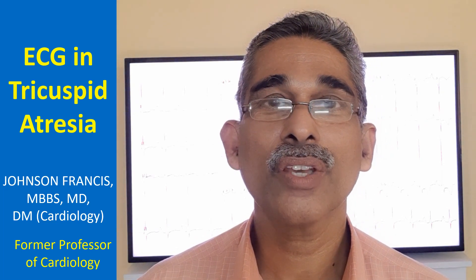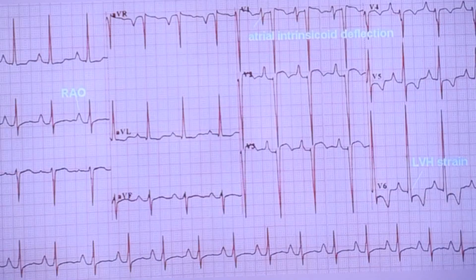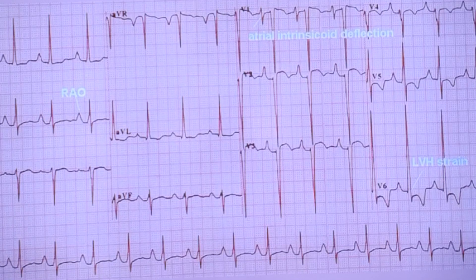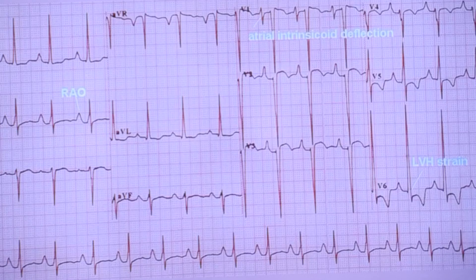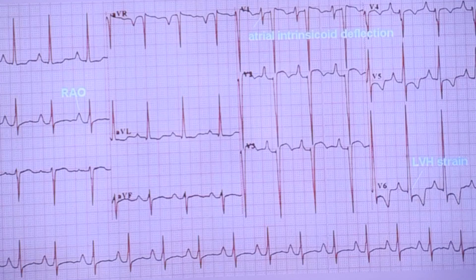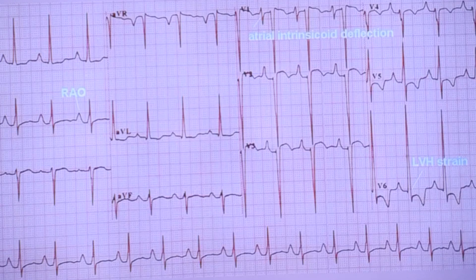That is how you think of tricuspid atresia from the ECG. Usually in a newborn, the right ventricle is dominant because of persistence of the fetal pattern. In the fetus, the right ventricle is dominant as the left ventricle receives hardly any blood from the lungs — the lung is not functioning. That pattern persists in the newborn for a period of time until the left ventricle becomes more prominent and the right ventricular musculature regresses.